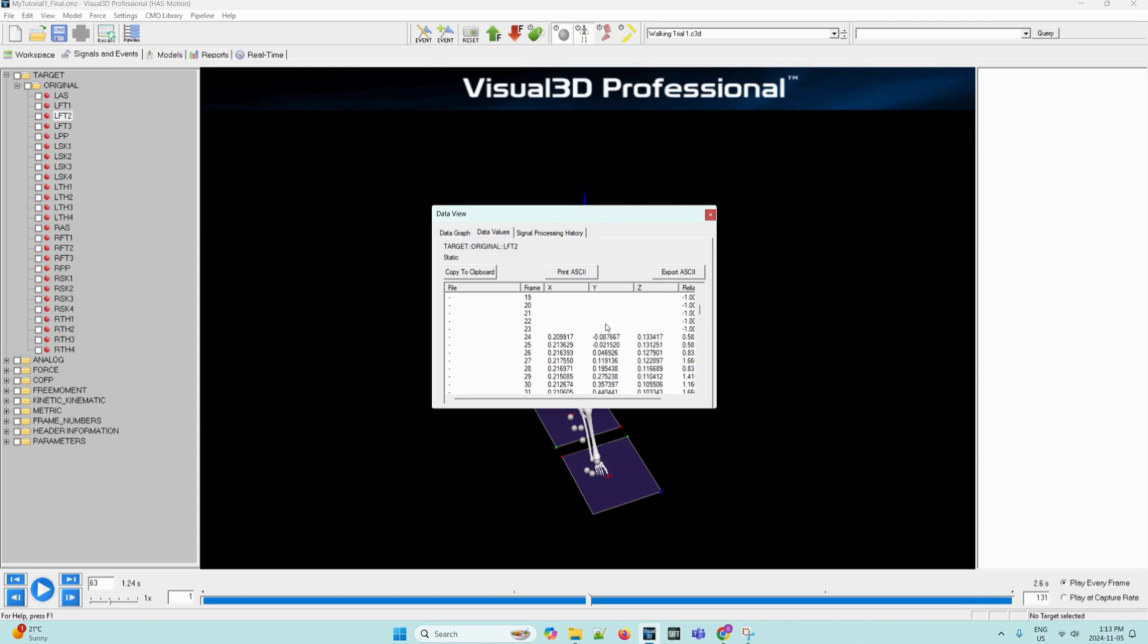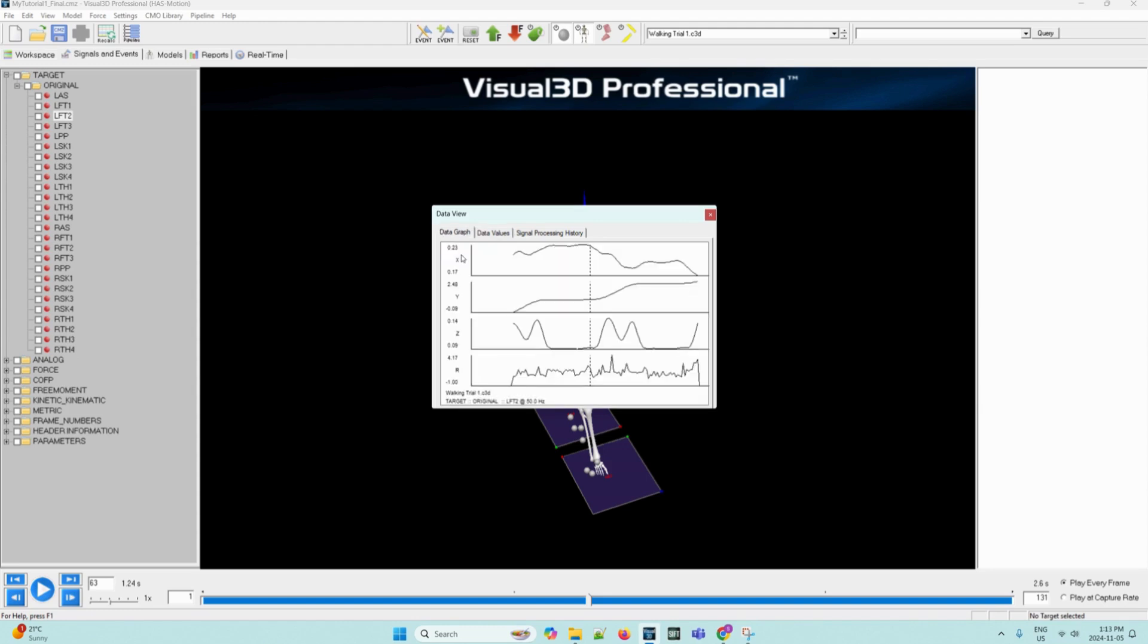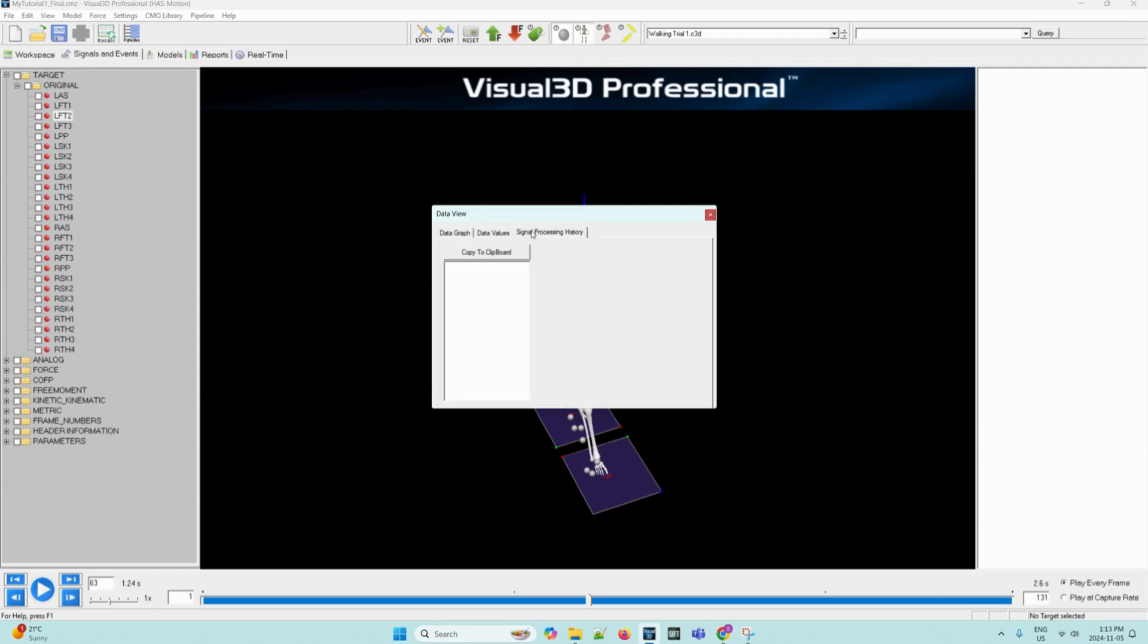If you see a blank frame in the middle of a data set, it may be an indication of an erroneous result. Within the same dialog box, we can open the graph data tab to view the analog graphs. A quick view can help you locate the obviously incorrect or noisy data available in these signals. Then we can open the signal processing history tab. Currently, this tab is empty, but you would usually view your processing history of signals here.